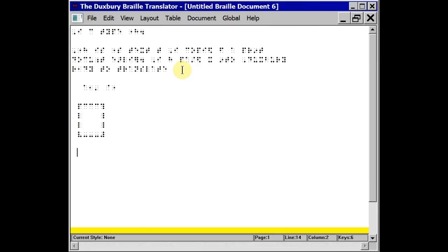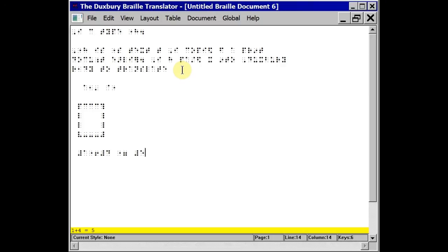I might also use braille key entry to do some maths. One plus four equals five.